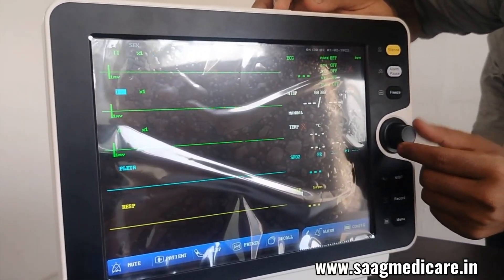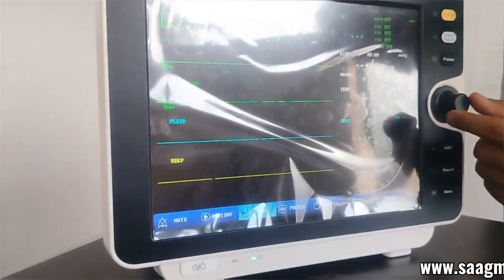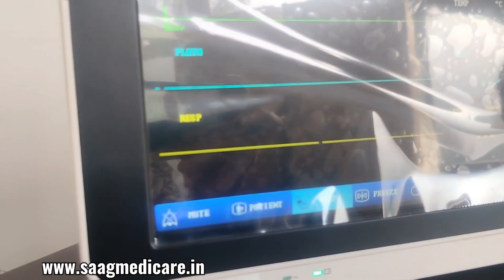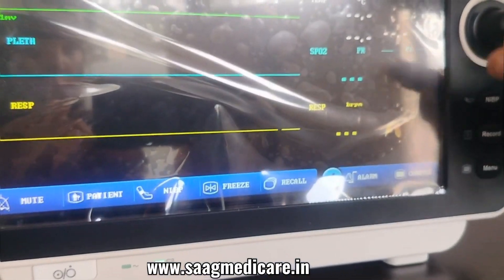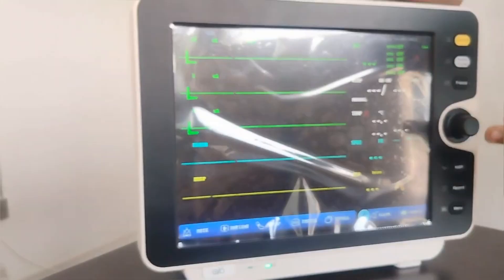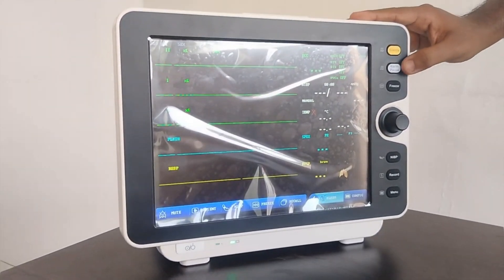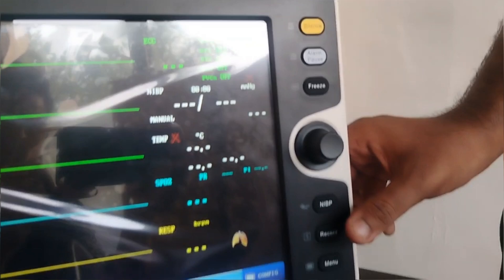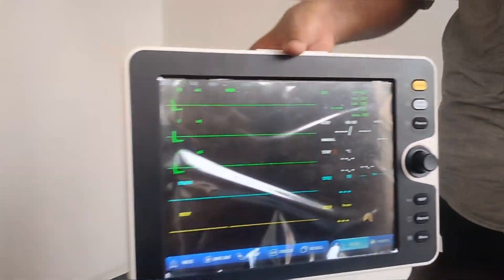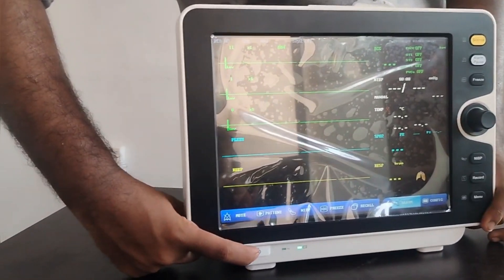At the bottom you can see there is a mute button, patient/new patient option, NIBP, and freeze option. The recall button is for recalling our records. There is also a silence button, alarm pause button, freeze button, and you can start NIBP by pressing this button. There is a record button and a menu button. To power off the device, just press the power button.